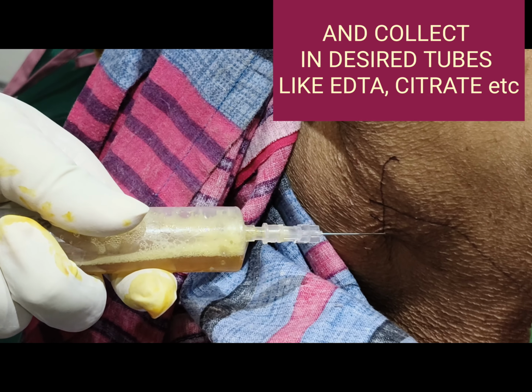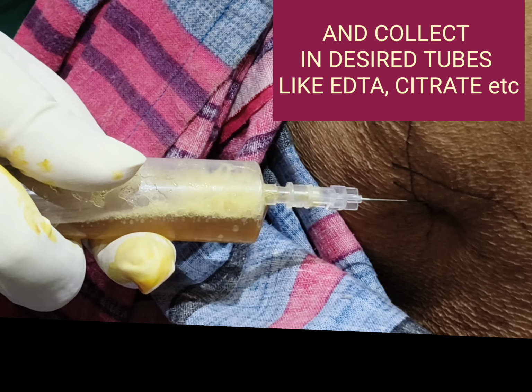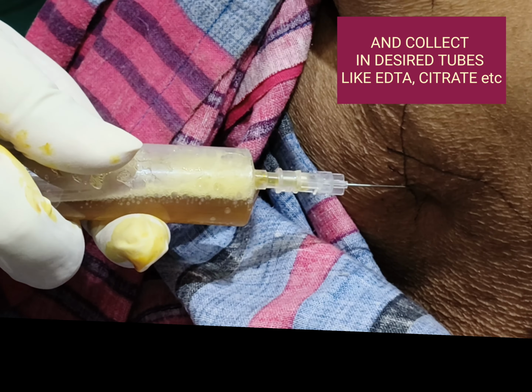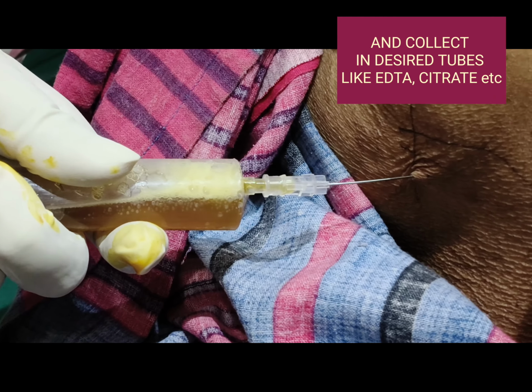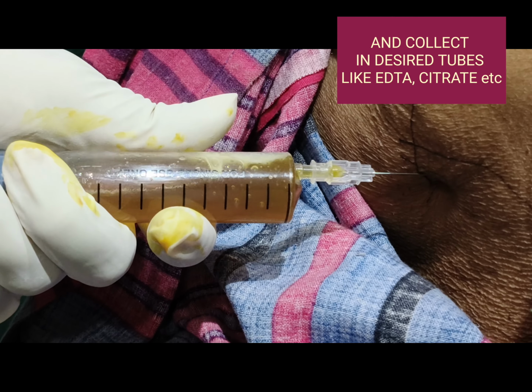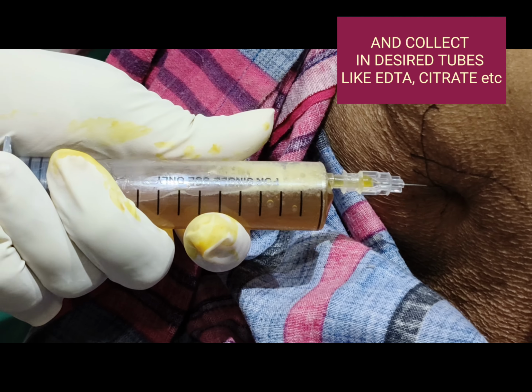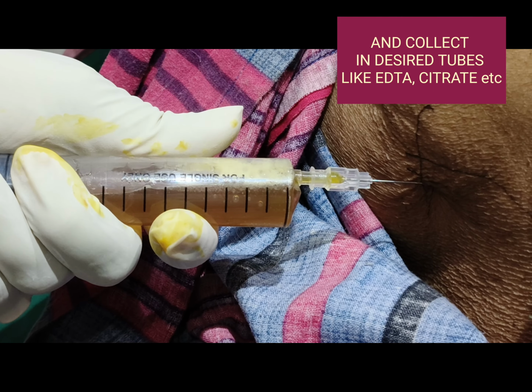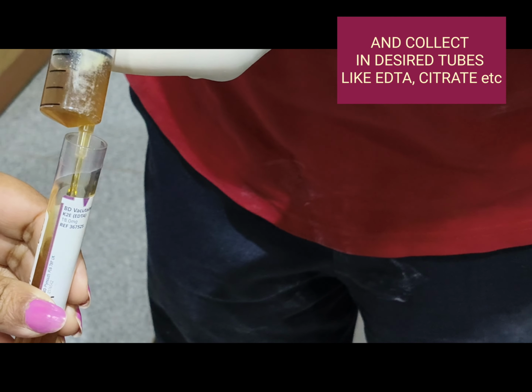We can see the fluid is coming out. There is a huge collection. We are collecting the fluid and transferring it to various types of tubes for cytological, biochemical and malignant cell studies and cell block preparation.